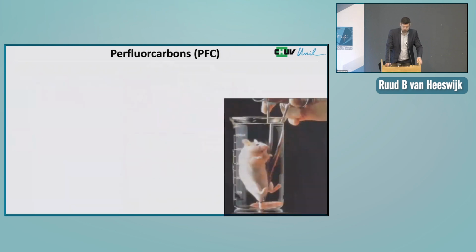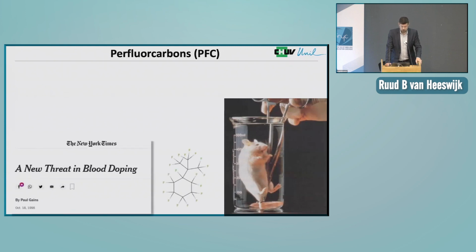And that's actually real. Here you see a mouse basically breathing in perfluorocarbon, because perfluorocarbon has a higher concentration of oxygen per volume than even air does. So this overcomes the partition coefficient for the lungs and so on. It's also, of course, then been picked up by cyclists because, of course, why not? Cyclists use this as blood doping. And the molecules look like the one you see there in the middle, so highly fluorinated. So all the hydrogen has been replaced with fluorine.